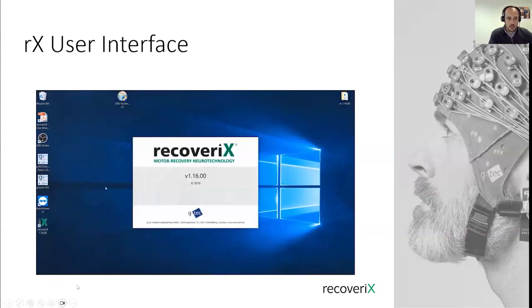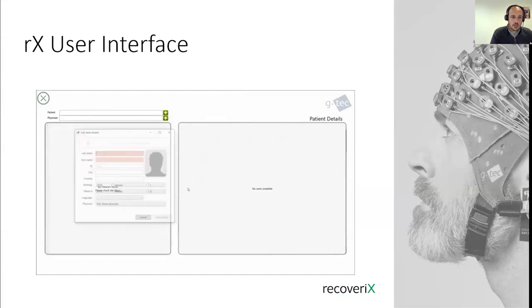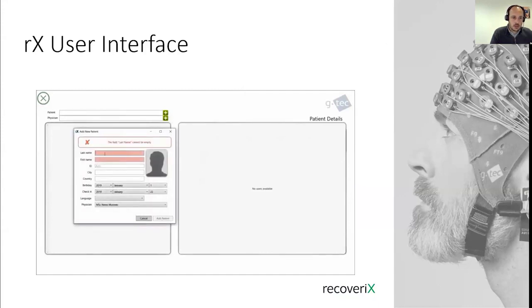How the whole procedure of starting the system works. So we have this icon on the desktop. We click on here. Then if it's the first time that you are using the system, you also need to enter the physician information, who is responsible for delivering the therapy. Then we can add the patient details.